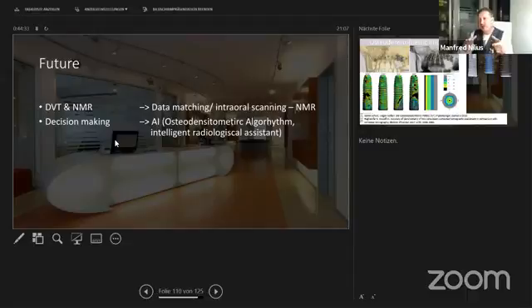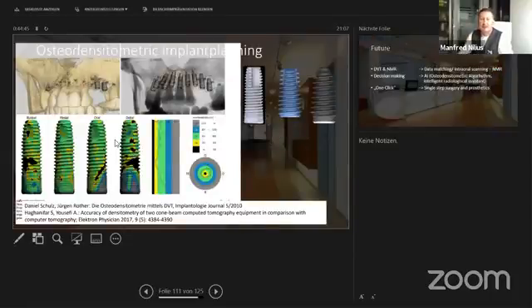So maybe you have different boxes, but in future, we'll have a small box with one drill for one implant that is the best implant for the patient. And this might be a parallel wall, or this might be a big cutting edge or apex or sharp threads.